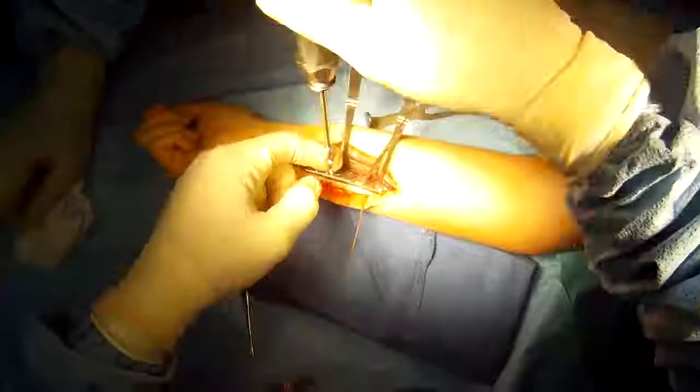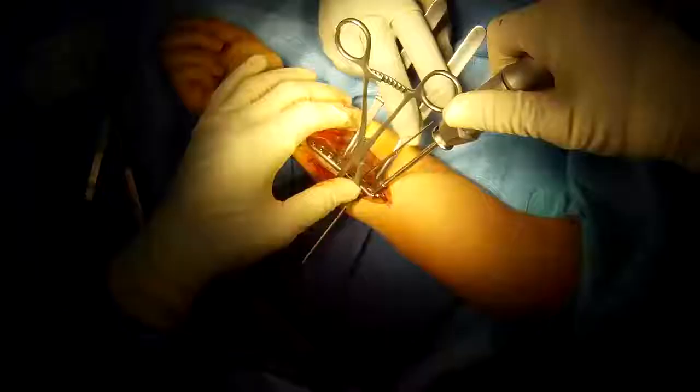This is what's called a lag screw. It goes between the two fragments of bone and provides greater compression and fixation to facilitate healing and stability.